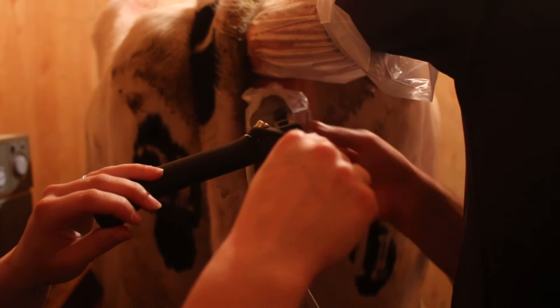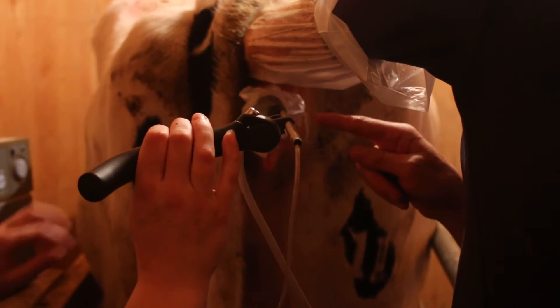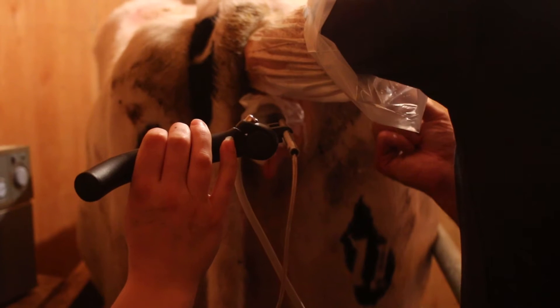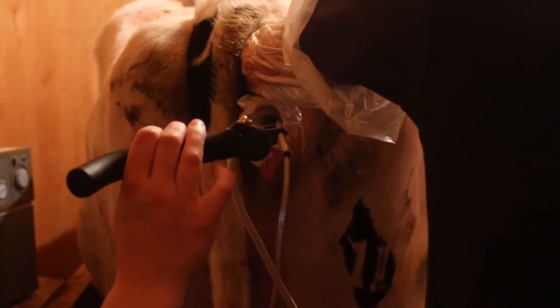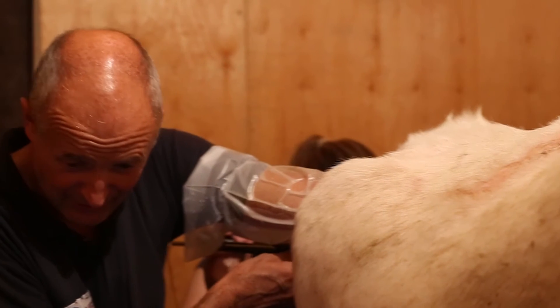The design of this handle helps Ros put it into that hole without jagging the end of the needle on any sharp edges, which is really useful. And she doesn't stab my finger anymore either, which is great.